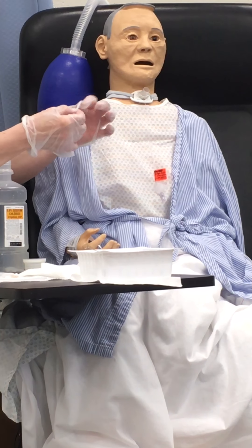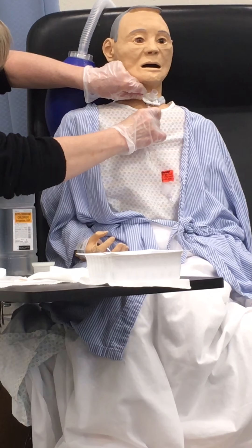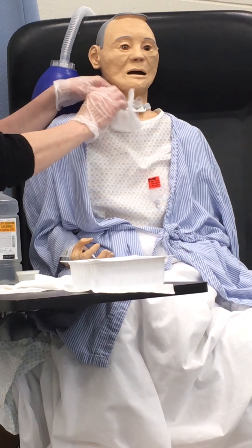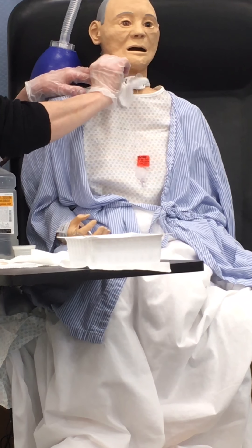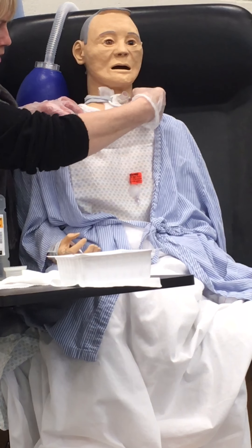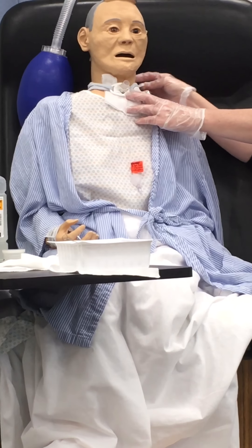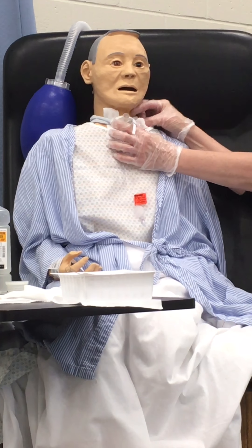Now we're done being sterile for all intents and purposes. If I needed to put saline on it I could, but otherwise just cleaning. I want to inspect that stoma — make sure it's clean. I could use that Q-tip or any of the products I have. Dry it off. Now we're ready for the drain — the best way to do it is like a sliding action. Some people go from the bottom up; either way is fine. You just want to make sure the balloon's on top. Kind of ease it over — I might need to walk around so I don't cover her trach. Just make sure you don't poke.